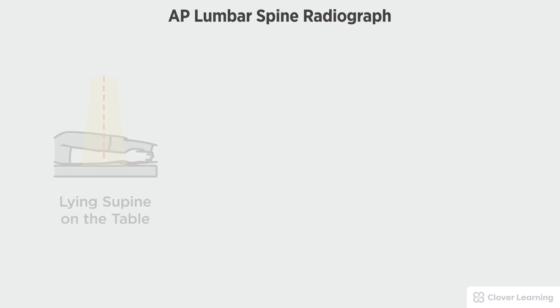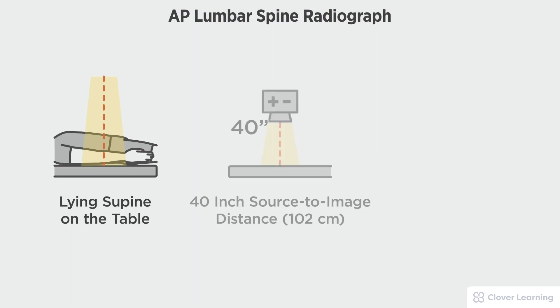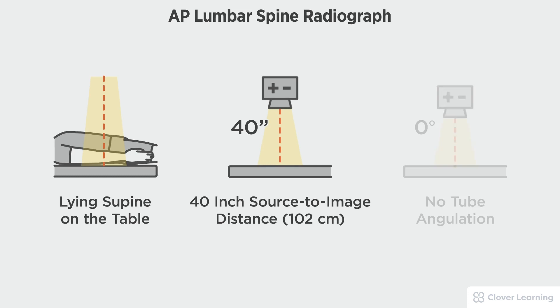In this view we will be demonstrating the AP lumbar spine. The AP lumbar spine should be performed with the patient lying on the table with a 40 inch source to image distance and no tube angulation.